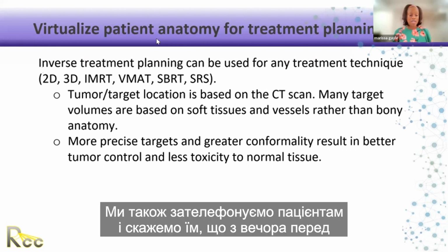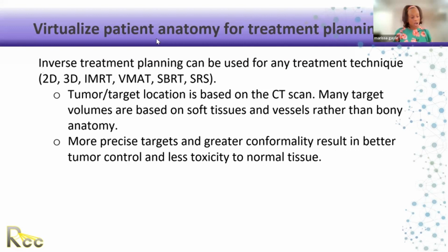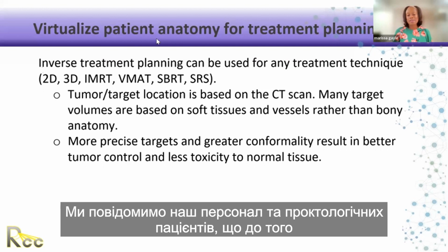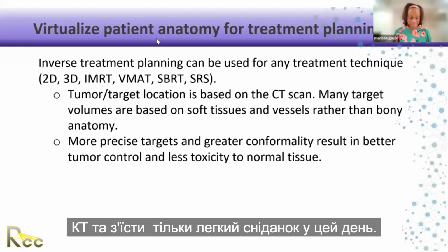We will also call patients the night before their scan and tell them they need to not eat anything for 4 hours. We let patients know, for example, our GYN patients, that they may have to have a Foley catheter inserted. We will let our prostate patients know, by the way, you need to do a bowel prep before you come in for your CT simulation and have a light breakfast that day.